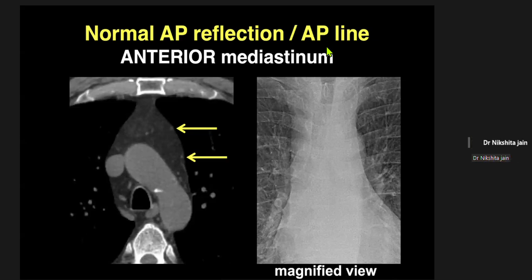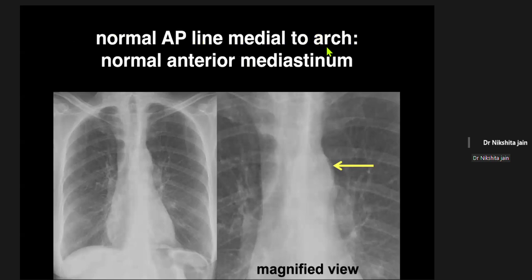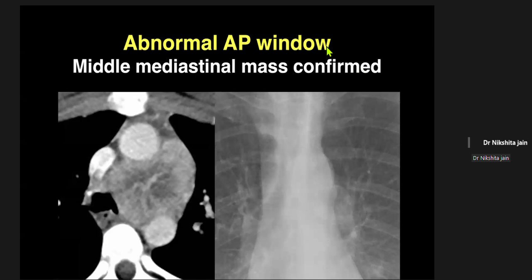Got it. The next question is by an anonymous attendee who is asking, please can you explain how to differentiate a lung mass versus a mediastinal mass? I also have a similar question from another attendee, who is asking that the mediastinal mass has an obtuse angle with the lung parenchyma, but how do you measure it on the radiograph?